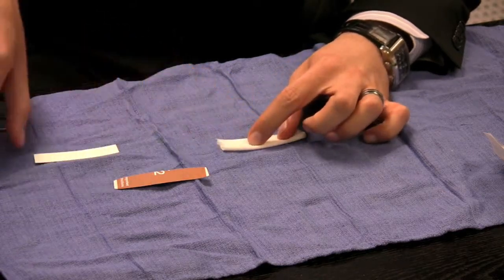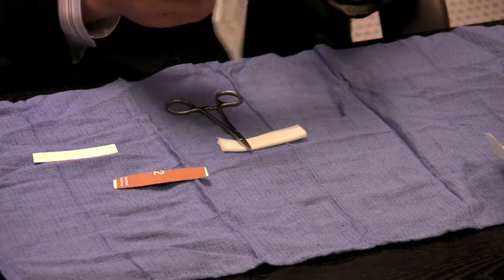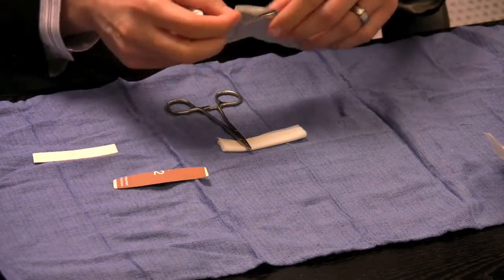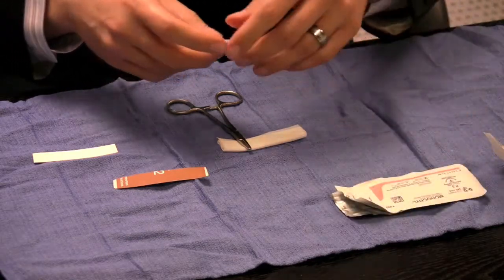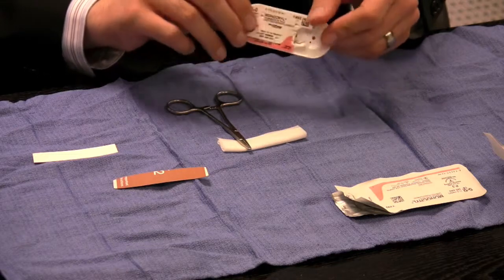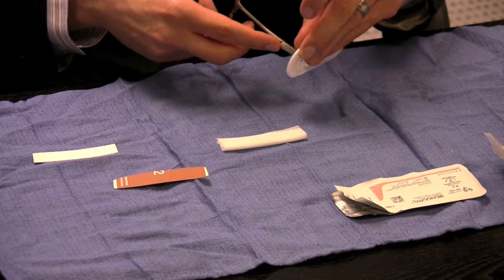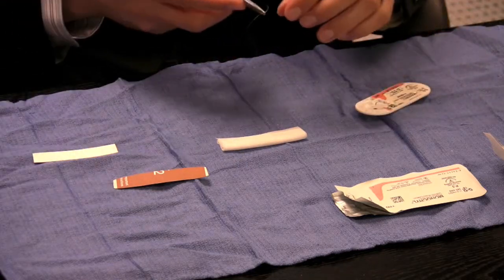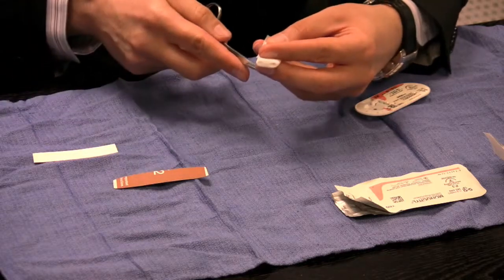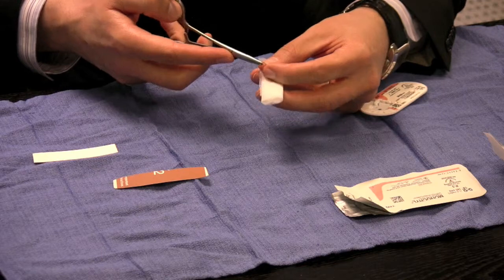So at this point, what I do is I take this chin implant, and the ones who have been to my website and know my preference, I don't really like permanent sutures anywhere in the body other than for otoplasty, and we can talk about that later on. But I use an absorbable suture called Monocryl. And I take this suture, and all I'm doing is just fixating this chin implant. It's one stitch, it just holds things together.